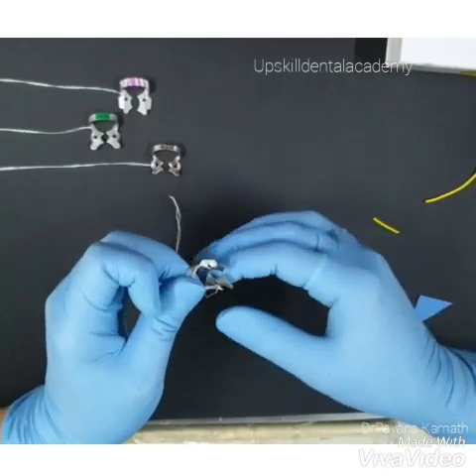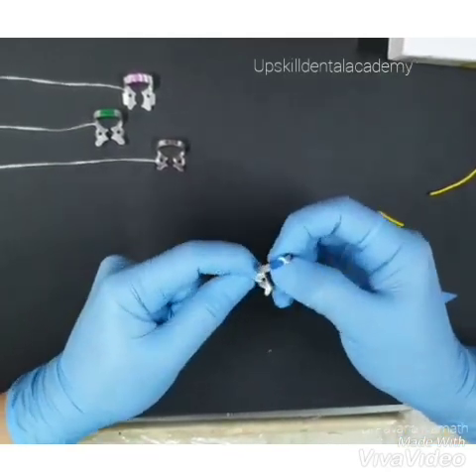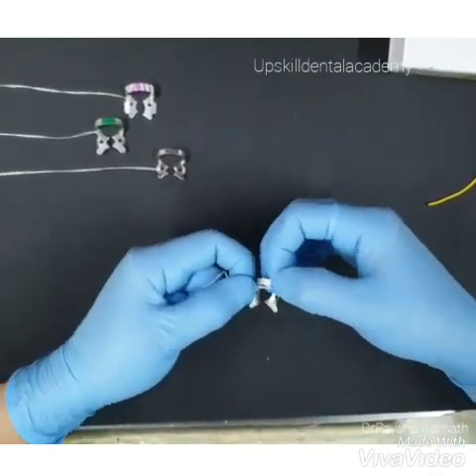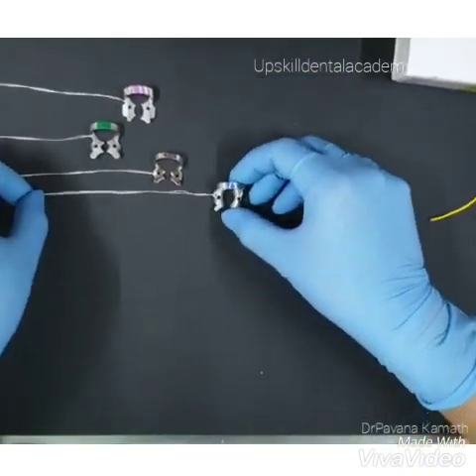So the free end is again placed outside. You can tie it to the Rubberdam frame. So these are the four methods how we can secure the floss around the clamps before placing them on the tooth.